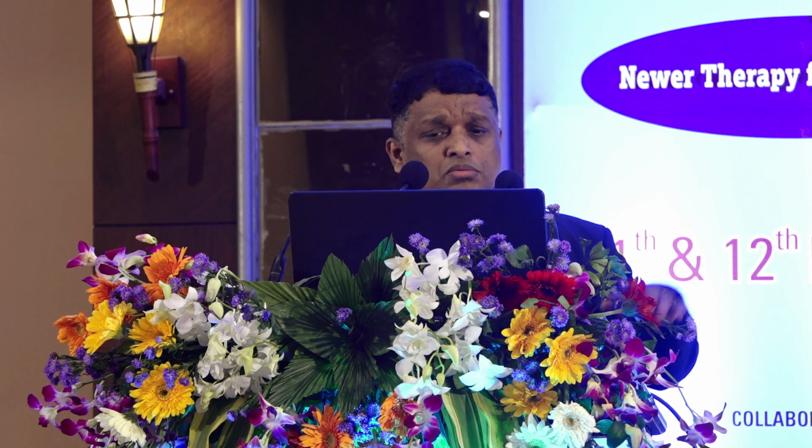The TRUS probe, we usually use a floor mounted stepper. There is another stepper which is couch mounted. We use a floor mounted stepper so that nobody needs to hold the TRUS probe. It's very easy so that the images are very stable. And initially we are obtaining the ultrasound images, the BK ultrasound images. You can see the clarity of the images, the different planes, the base plane, the reference plane, and the apex. This is the bladder you can see.